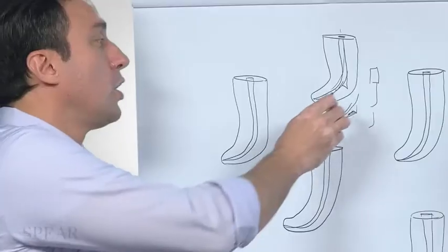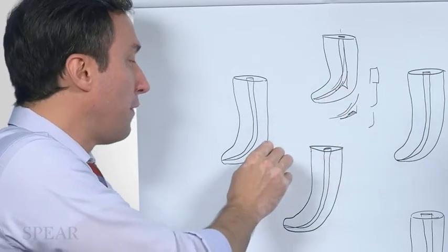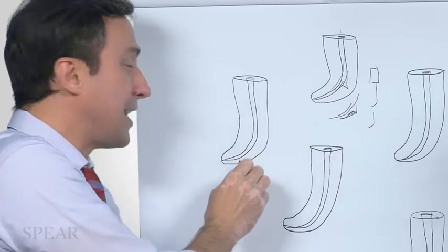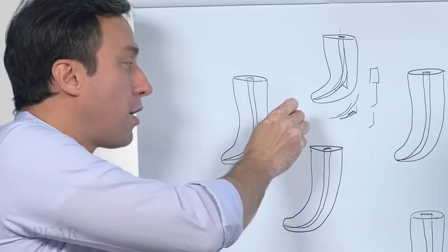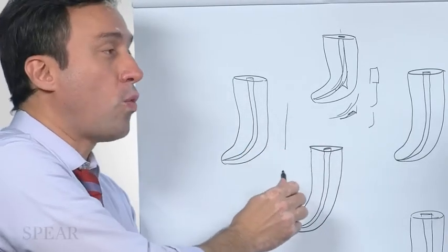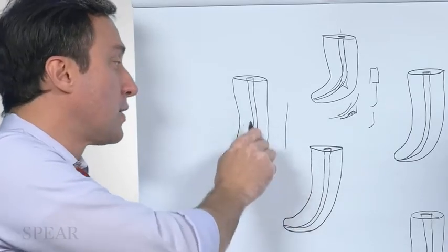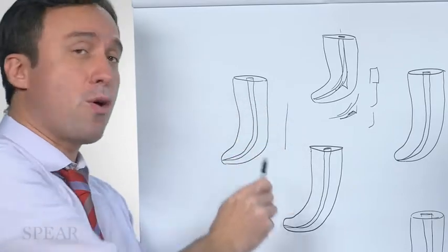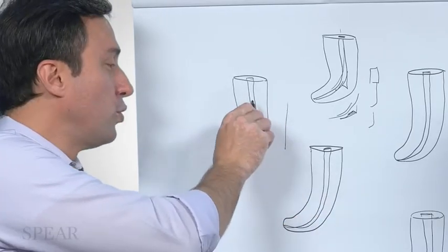Transportation is when you have a ledge and you continue to work, or if you have an instrumentation that you stay in one place for too long. Because remember, all NiTi files are straight, and they have a tendency to want to straighten out. All the austenitic files want to do that. So that's how orthodontics work, right, with the NiTi wires. That's how they generate that force to move the teeth.